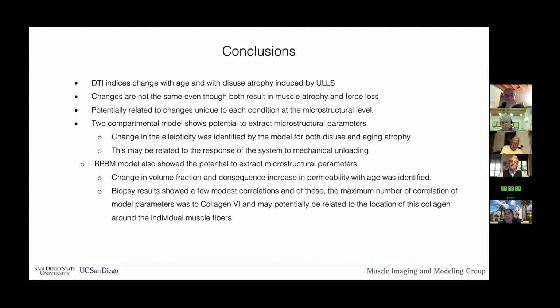Yes, that's a very good observation. And in fact, Shantanu did not talk about it, but we also have DTI and the opportunity to do fiber-aligned strains. So the strains along the fiber could give us more physiological parameters about the deformations. Yeah, and we hope to use this technique to estimate the lateral force transmission.